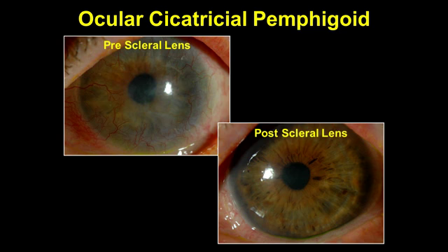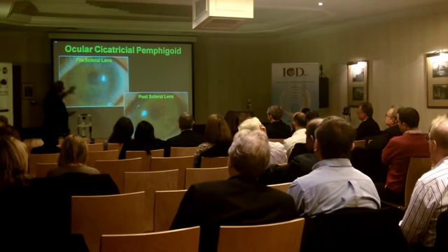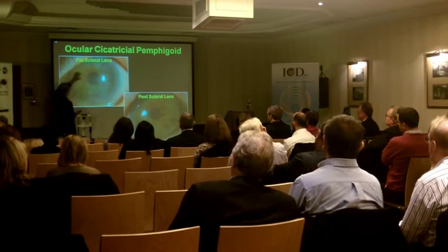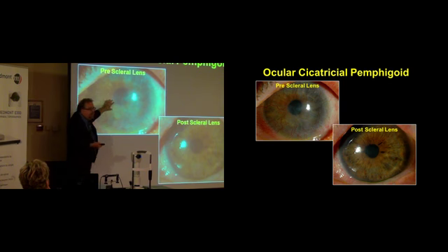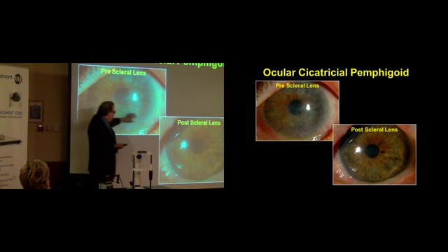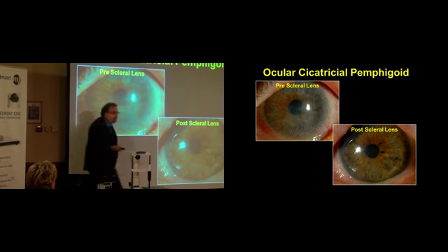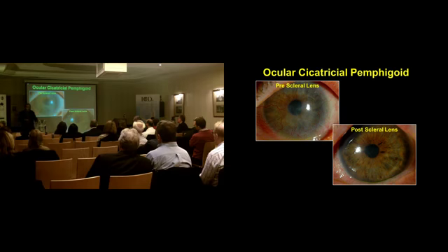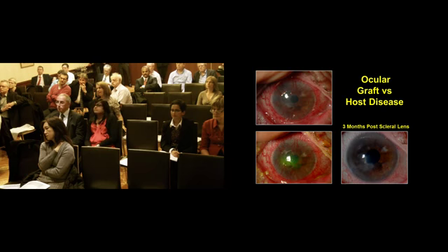We know that when we put patients with ocular surface disease, this patient with severe pemphigoid, and we leave the lens on, within months, their corneas begin to dramatically improve, both in the amount of vascularization, in the amount of edema, and these corneas go through some remarkable changes.